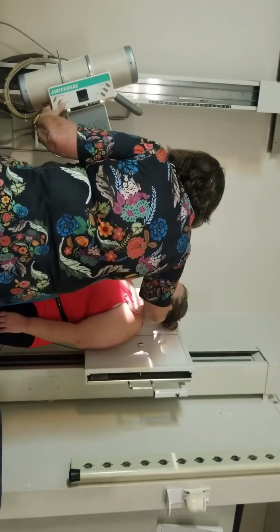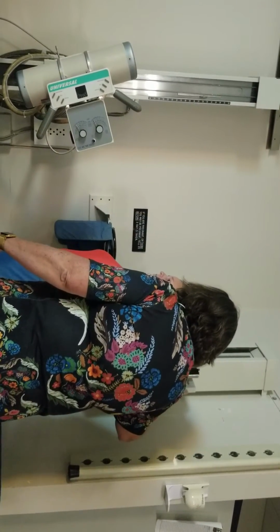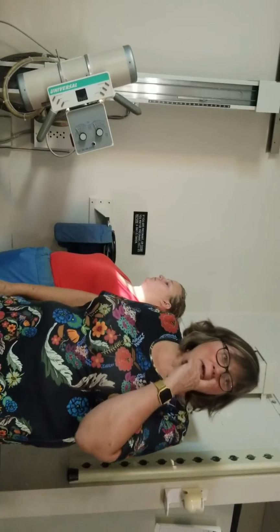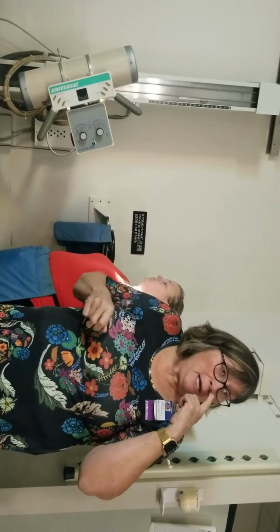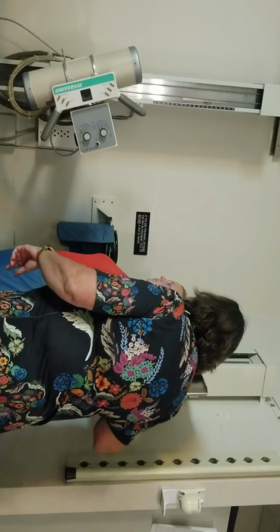I'm going to center my CR right on my clavicle. The only tricky part is you got to remember to pull your film out and center to your IR. Okay, that's the one thing people forget. Once they angle, they forget to move their bucky. So remember you got to center your bucky.